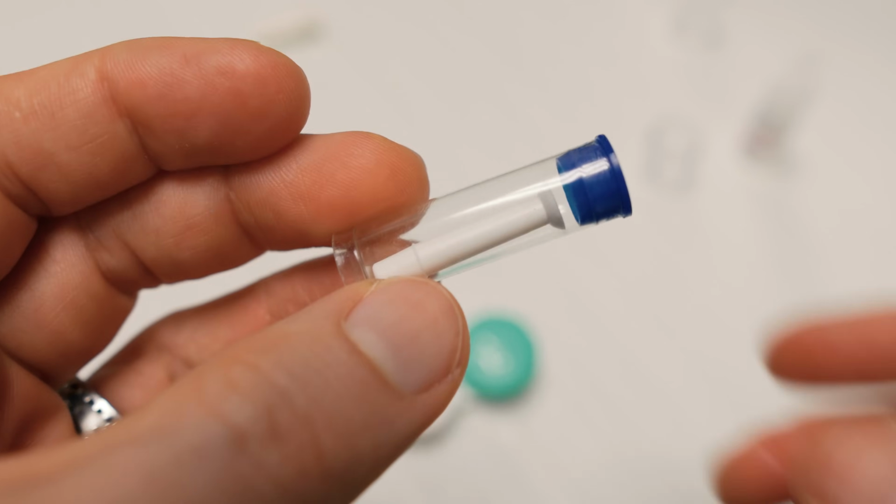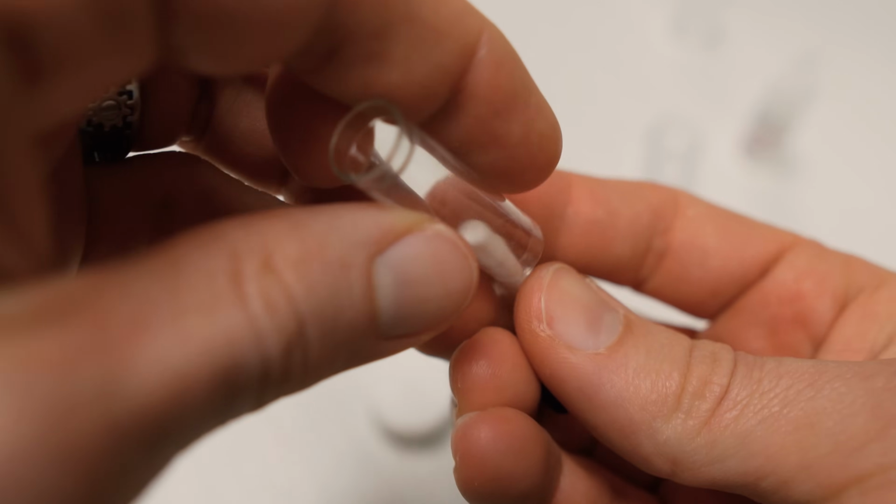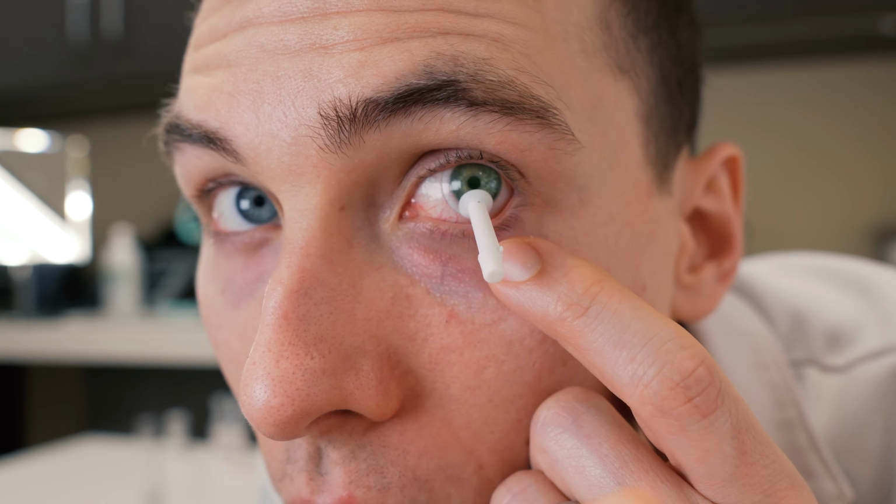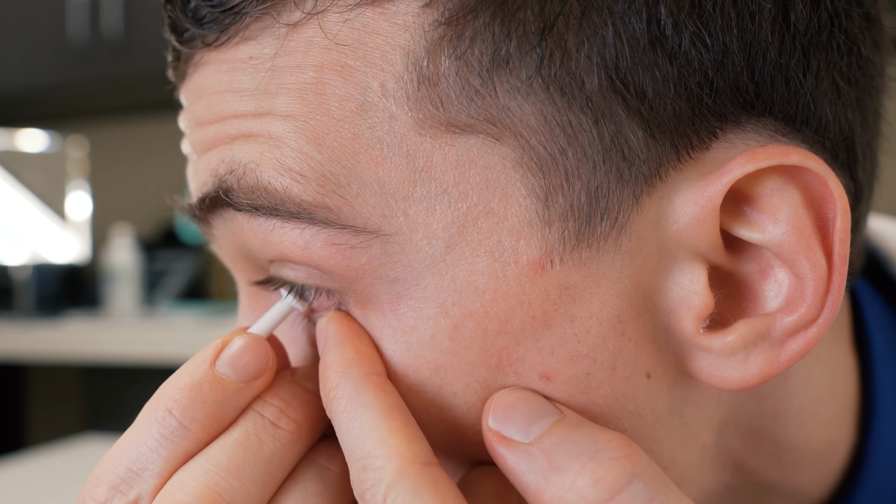Now, to remove a scleral contact lens, there are a couple of different methods that you can use. However, I still like to use a plunger. This plunger is a little different than the first one we used. This one is a little smaller and is the exact same one you can use to remove things like hard RGP lenses. First, you want to wet the plunger and then aim the plunger at the lower 1/3 of the scleral lens. Then you will pull up and out until the scleral lens breaks suction.